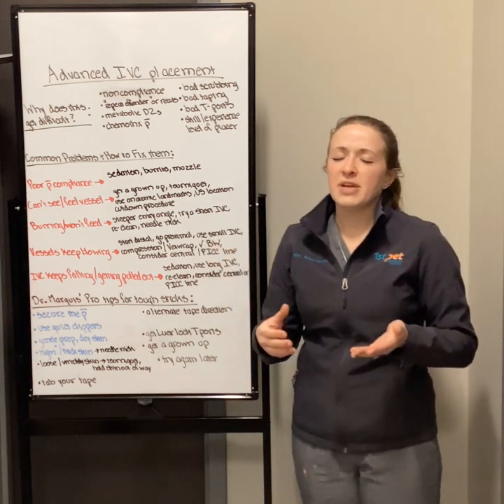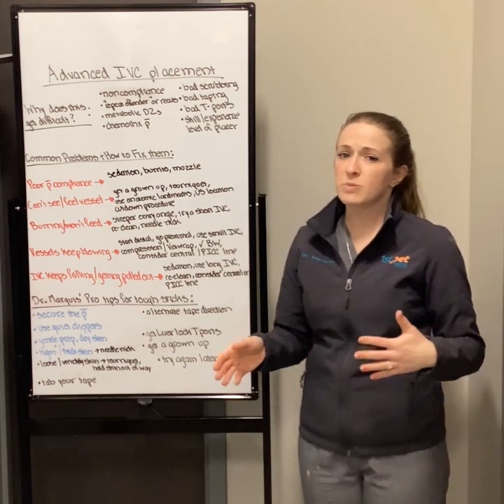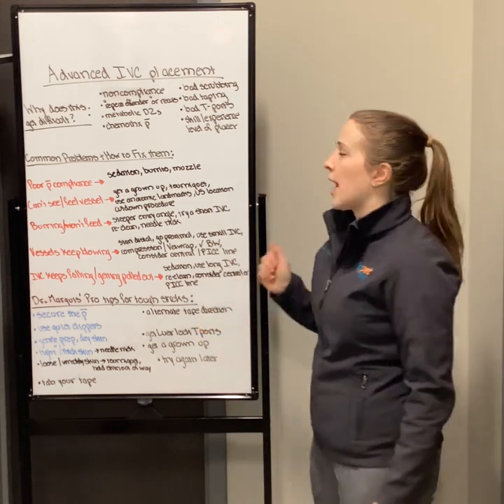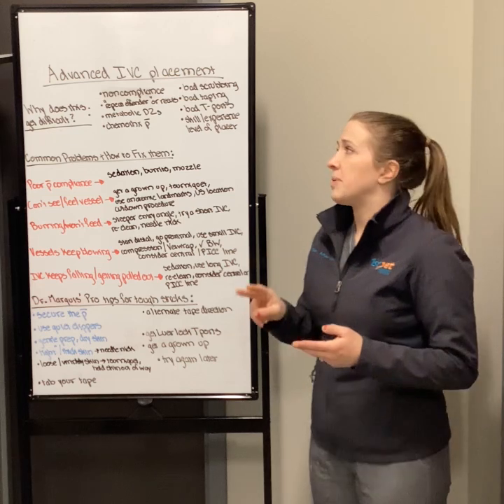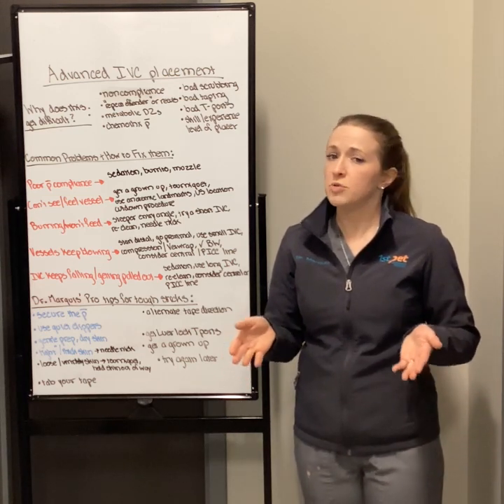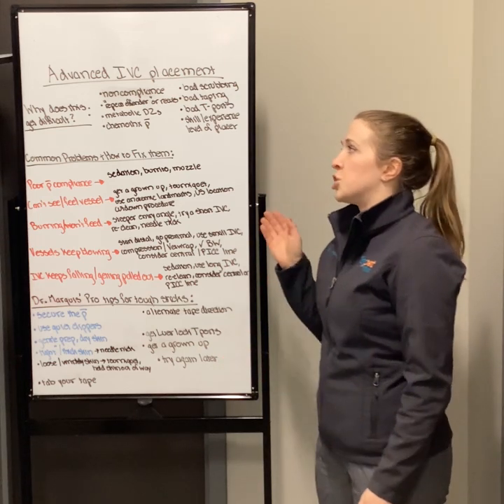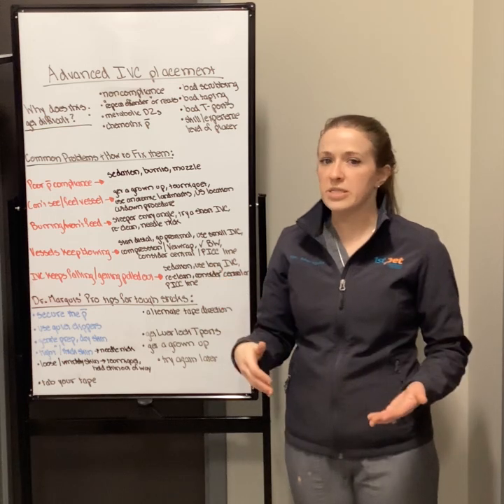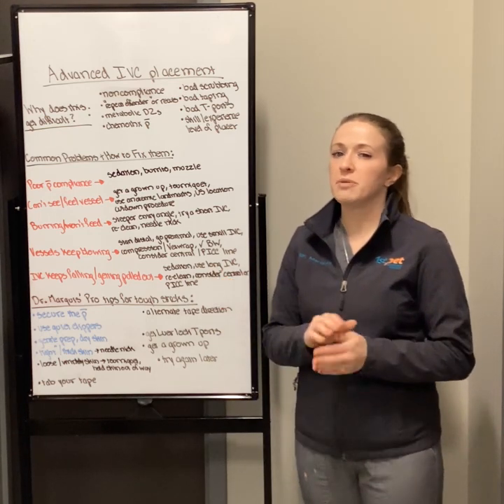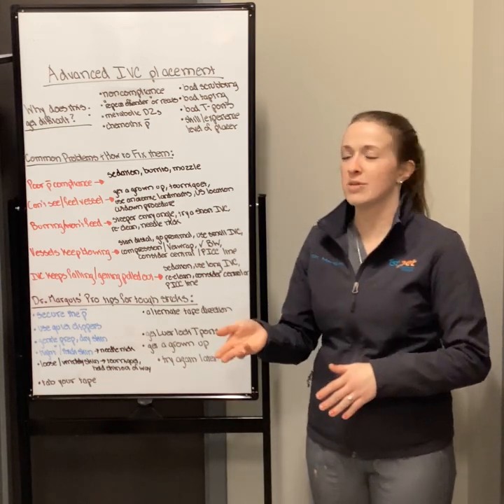And then a couple of things that have to do with your technique. Sometimes it's about the animal and sometimes it's about you and sometimes it's just bad luck, right? But things that have to do with us, which make catheter placement difficult: bad scrubbing, bad taping, bad equipment, or T-ports. If you try to secure a catheter to skin that is not clean, the catheter is not going to stay in place. If you use a cheap brand of tape or tape that is not very sticky, so that tape that's kind of shiny on the top but sticky on the bottom, that doesn't usually work on animals, but it works great on people who don't have haired skin.